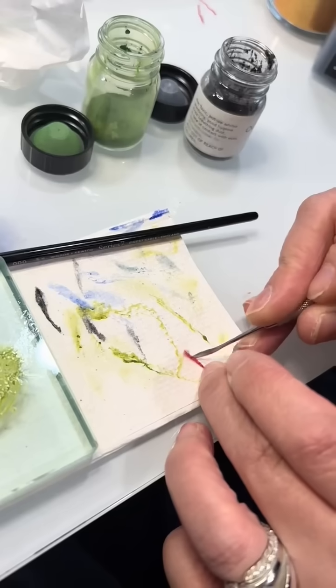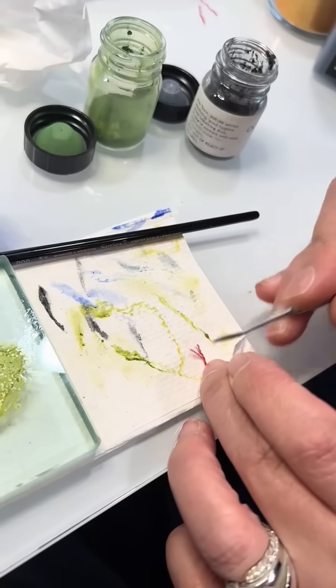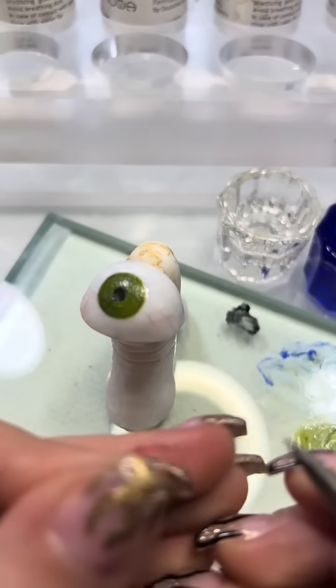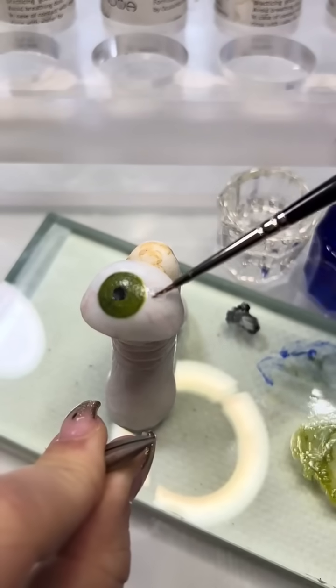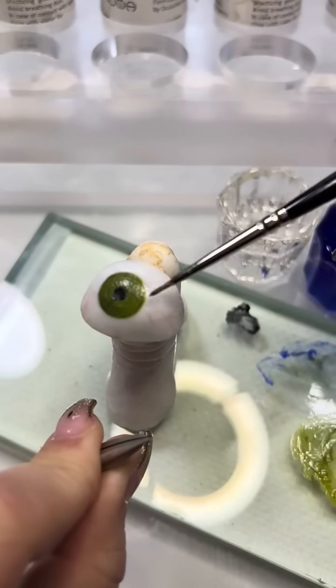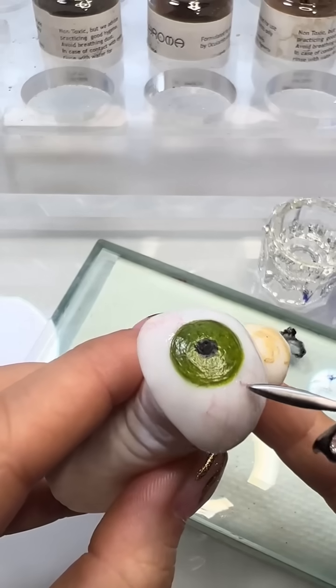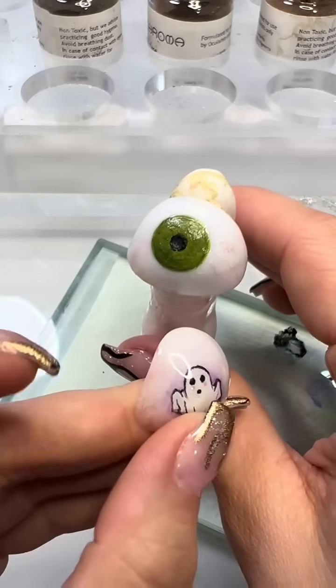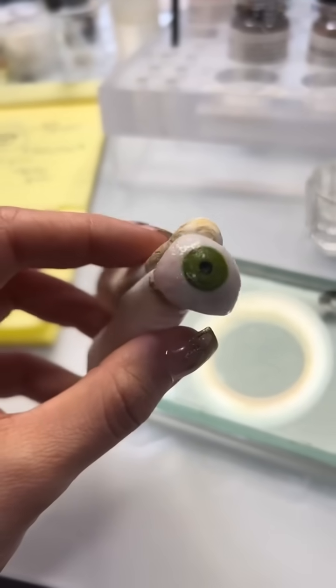Now on to what was my favorite part, laying the veins. Now growing up, I always thought that the veins on my prosthetic eyes were hand painted on. They're not. You actually place tiny pieces of yarn, like a single little strand, onto the eye by first laying a layer of the polymonomer and then kind of positioning it so it looks proper. The spread and density of the veins depends person to person, but this part I did all by myself, so I'm super proud of it.